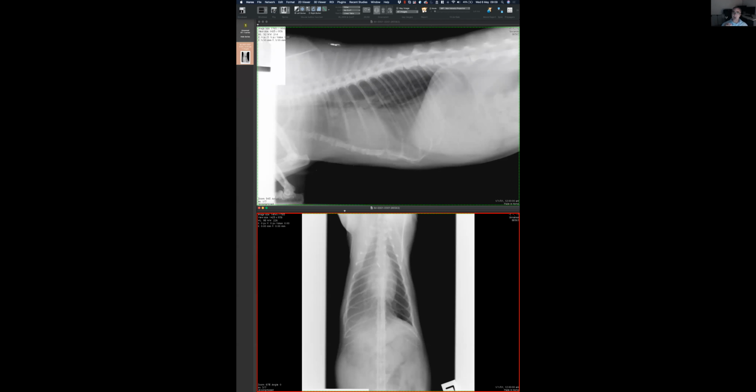And again, this exercise is hard because I think the brain automatically tries to explain things, and things that we cannot explain, we don't even mention. Make sense? This is how we usually operate. I invite you to try to stop that, which is extremely hard, but don't try to explain, just call what you think is abnormal.